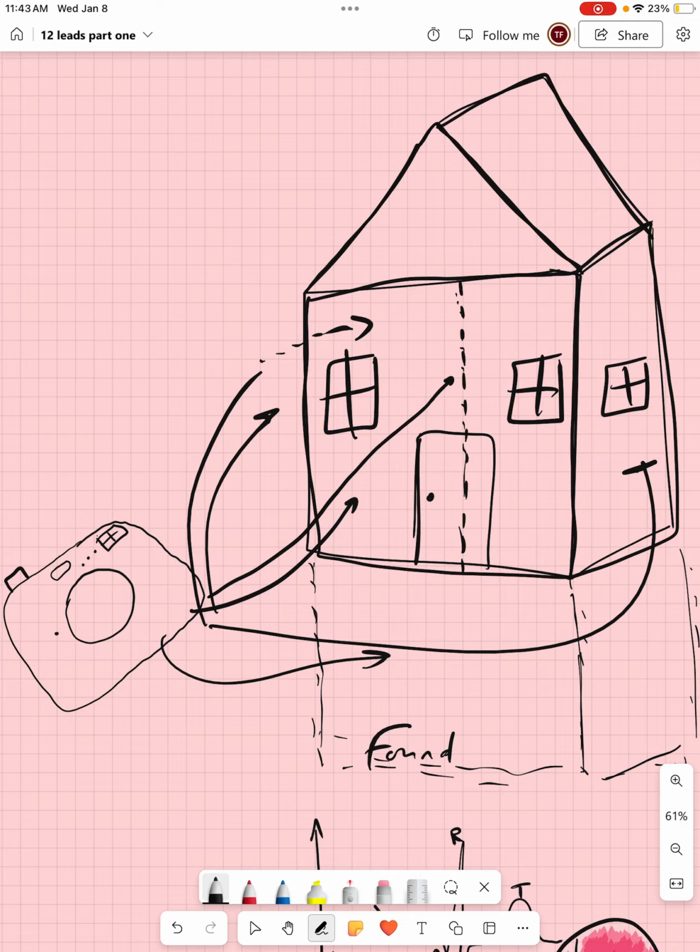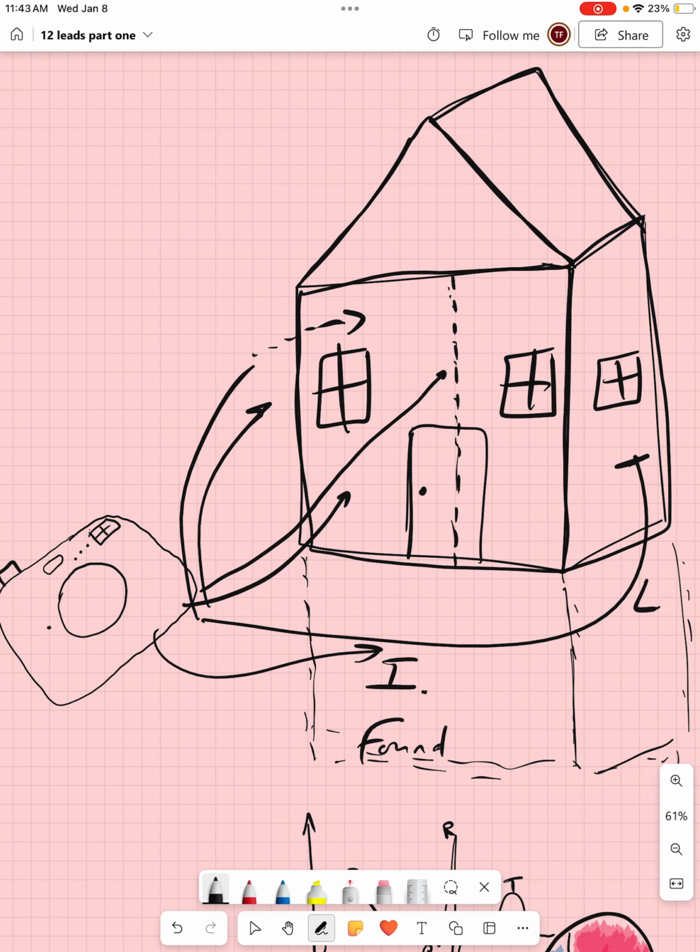And so just like this 12 lead, we are taking pictures of the inferior portion. We're taking pictures of the lateral portion, the anterior portion. Oh, I mixed up these, sorry. Anterior portion and our septal portion. And we could even look posteriorly. Again, going into different setups with lead placement, there is a way to check the posterior portion of the heart electronically. Generally it is not set up like what we just reviewed, but there are ways to do that.